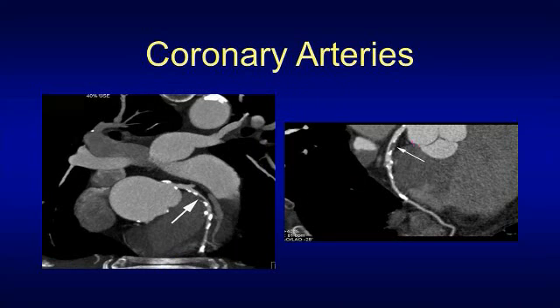Coronary artery imaging requires a gated acquisition so that we can evaluate these small vessels at a point in the cardiac cycle where the motion artifact is minimized. Here is a patient who was being imaged for the ascending aorta and who also has coronary artery disease. Many of these patients will have concomitant disease in the aorta and in the coronary arteries.